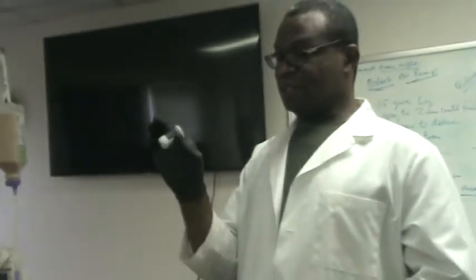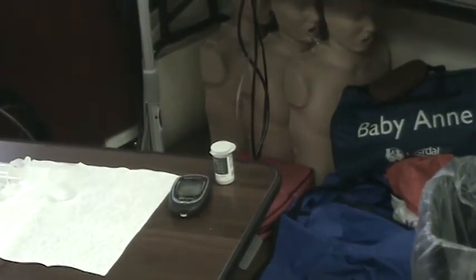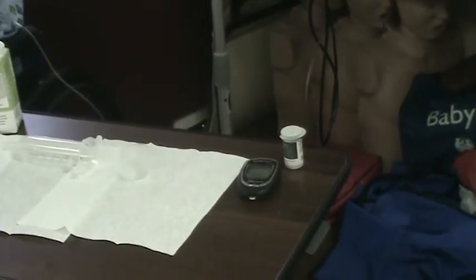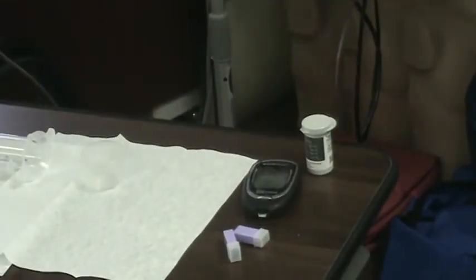Then you need the strip that will collect the blood to test with the machine. So you need the strip. You need to obtain the blood. You need a little lancet, like a little needle, to prick and get a drop of blood. There are different kinds of needle.